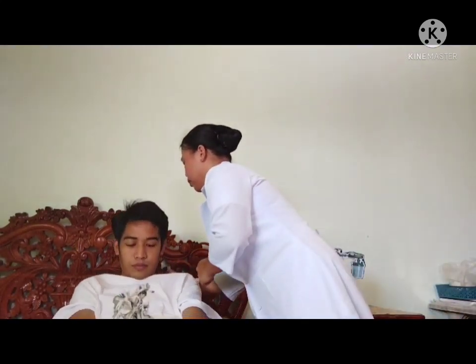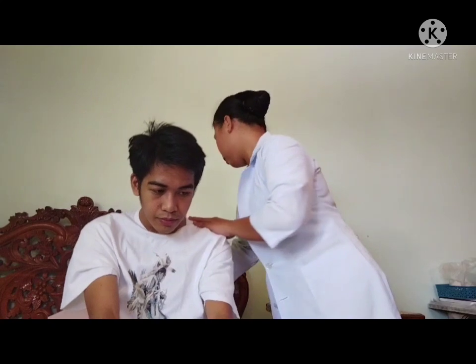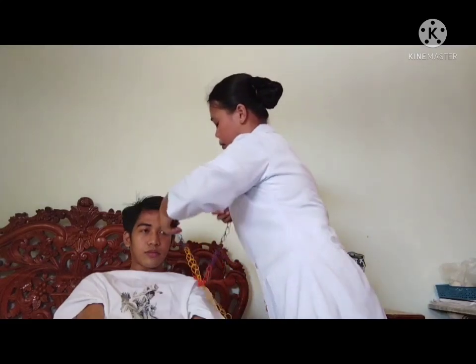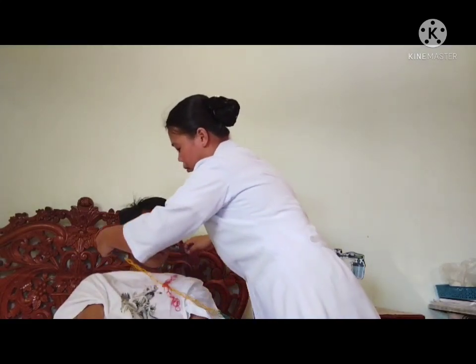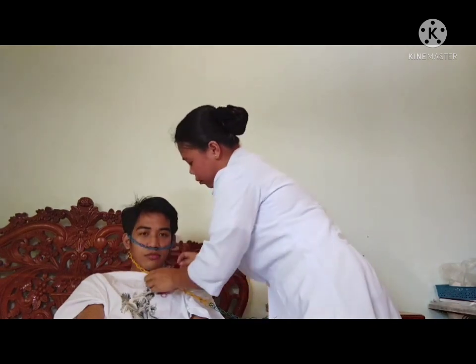Assist the patient. Place prongs in the patient's nostrils. Place tubing over and behind each ear with adjuster comfortably under the chin. Alternately, the tubing may be placed around the patient's head with the adjuster at the back or base of the head.